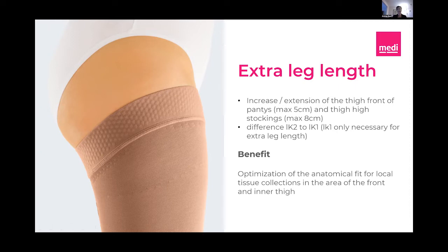And I keep saying we can't, because if we make it longer, your buttocks will push the band down, and the stocking will start rolling. It's going to be a hell. It's going to be painful.